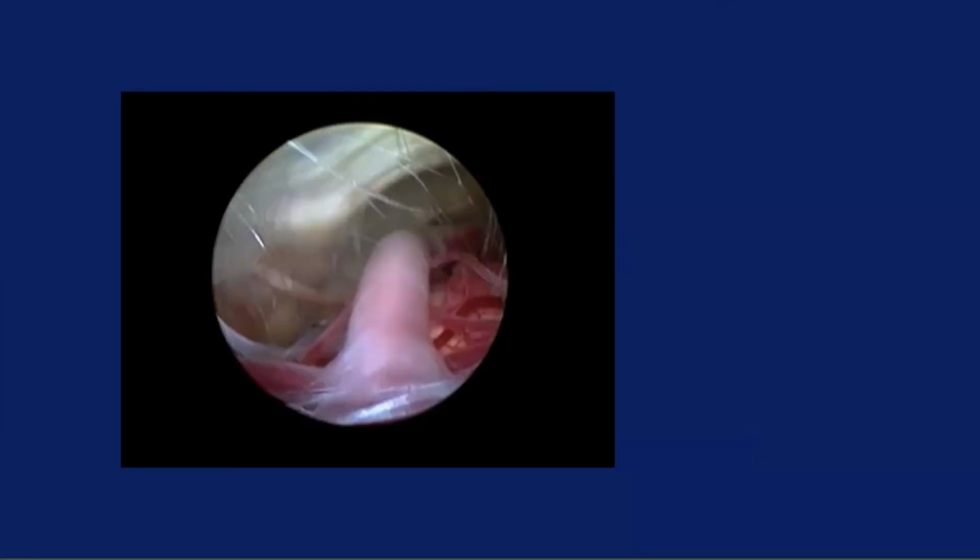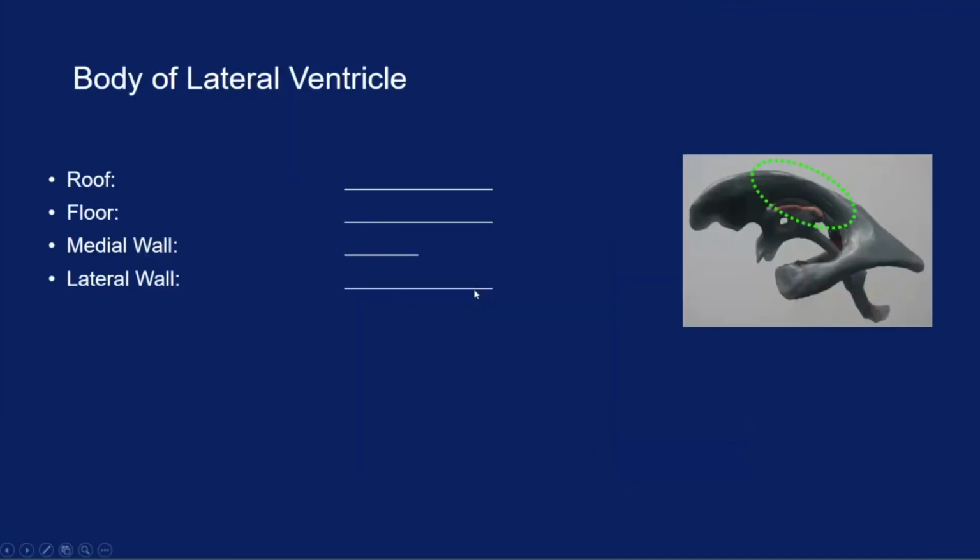So once you make the stoma, you see the basilar artery. You want to see a basilar artery and a prepontine space that does not have any scarring, and that's probably one of our most important prognosticators for ETV success. I think most residents should know that.